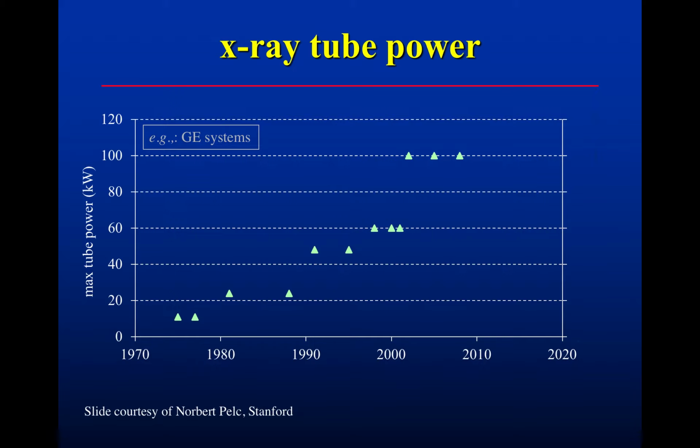These are specialty X-ray tubes that make huge X-ray flashes. And as you can see, up to 2008, and we're going up here with this new generation of tubes, where you're looking at 100 kilowatts of X-ray tubes. You know how hot a 100-watt bulb is, right?